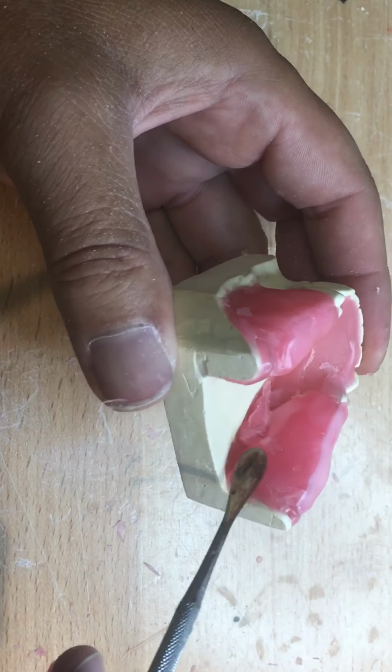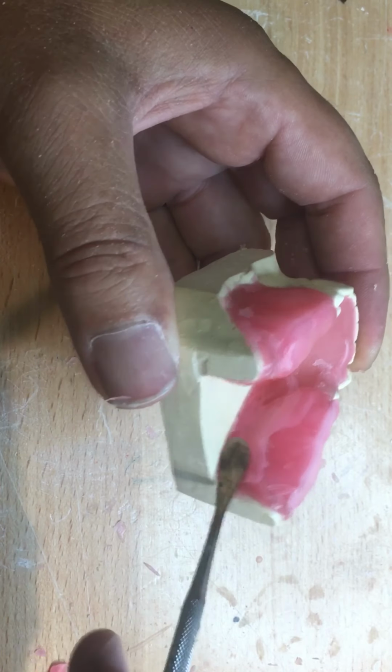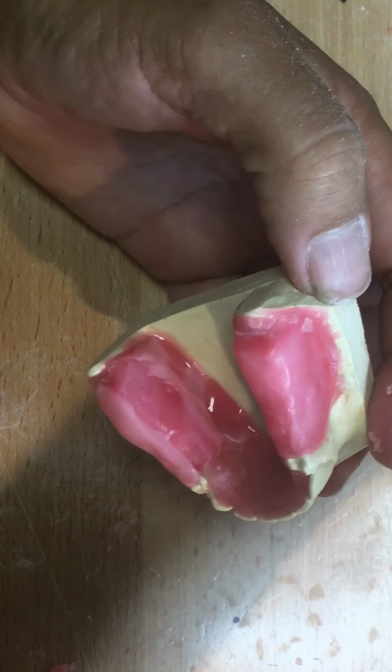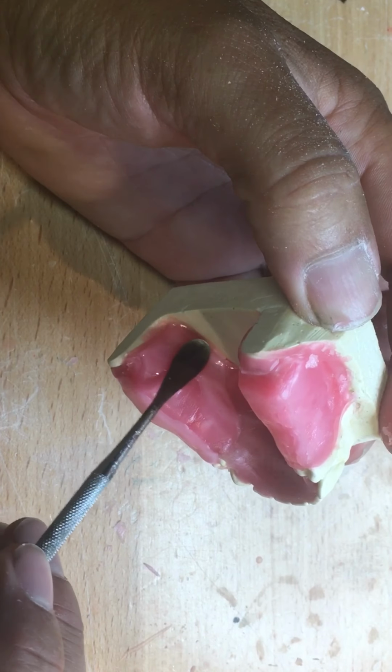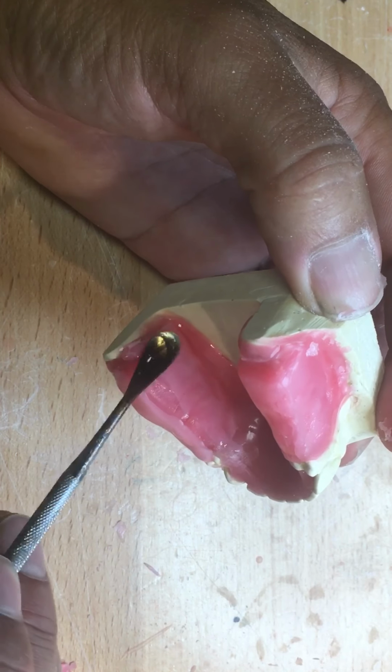So I'm going to flow wax all the way down because I really want that border to be well established and waxed, nice and round, smooth. So a little extra is not going to hurt there. There's many ways to do this, but I think this will give you decent results.